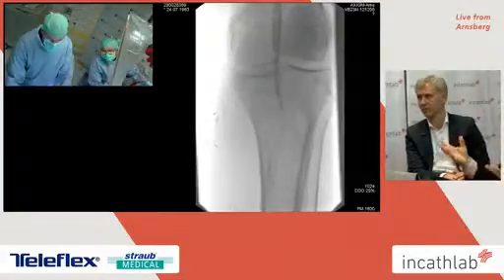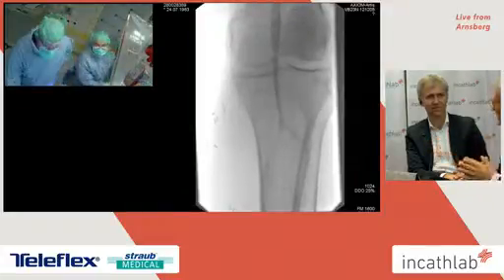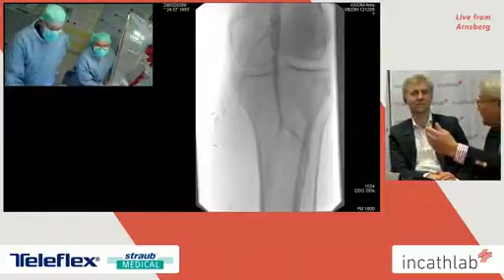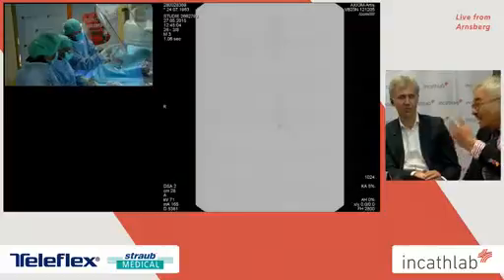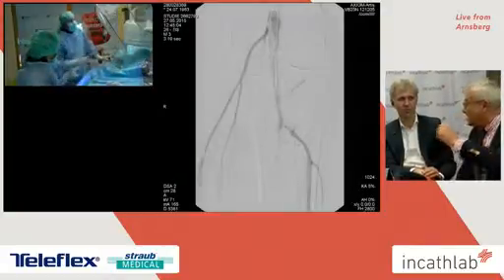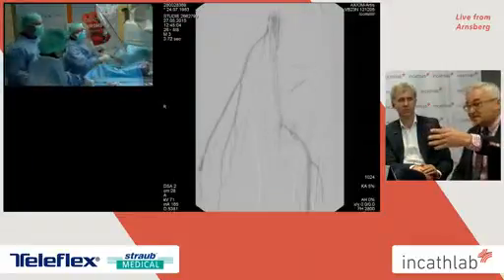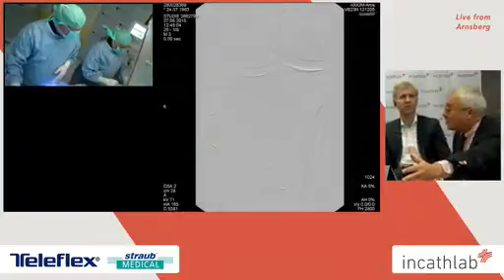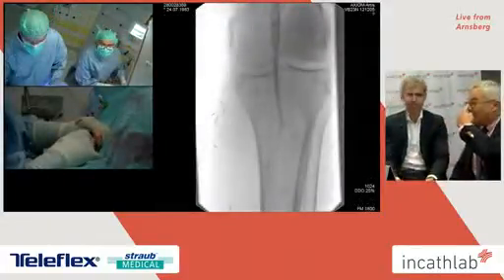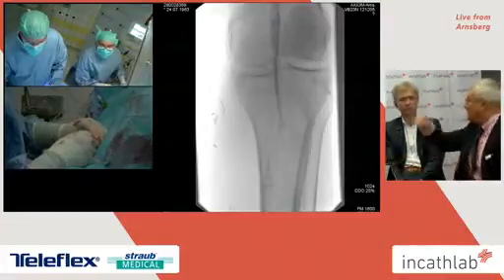I also would. My question is, if we had a distal embolization, for example, and so we need to aspirate, and with a crossover maneuver, the emboli could be very far away from our access, so it could be really difficult to arrive in the foot and aspirate.